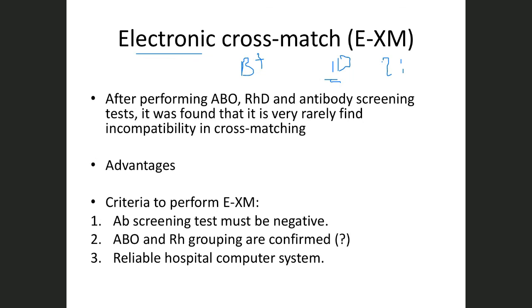Let's continue talking about cross matching. So there is no real cross matching. It will just choose and select and ask me to take this unit, compatibility tab. That's it. Do you remember when we said there are two parts? Some people said there is no need, and other people said it is still needed. So it depends on the blood bank. In some blood banks, we trust our system, we trust our technology, so there is no need to do cross matching.